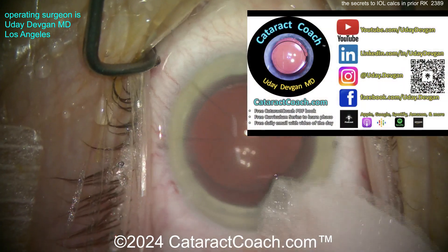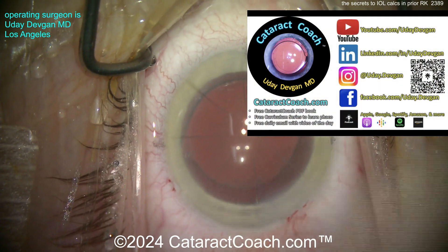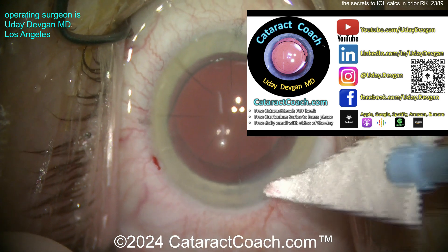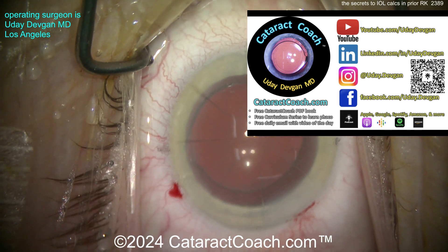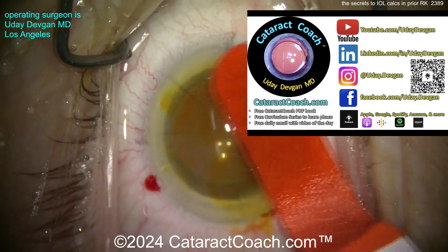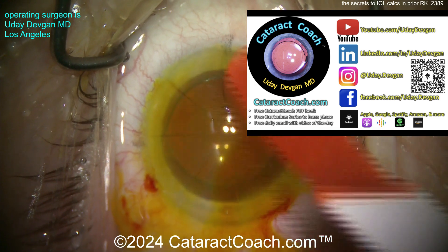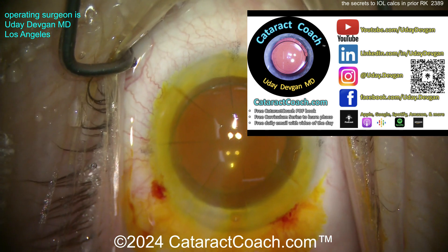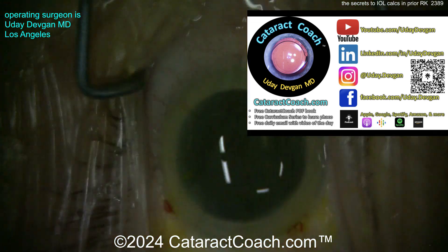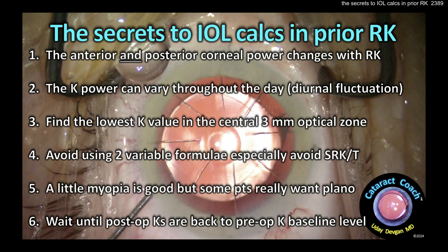Get the fluorescein dye out and check everything — make sure it's all sealed up, including the RK cuts. The Seidel test is negative with no leaking anywhere. Wash it off with BSS. This patient had a beautiful outcome. We also have a top podcast in ophthalmology — free, educational, and designed to make you a more successful ophthalmologist. Remember those six secrets and take them into account the next time you have cataract surgery in a post-RK eye.